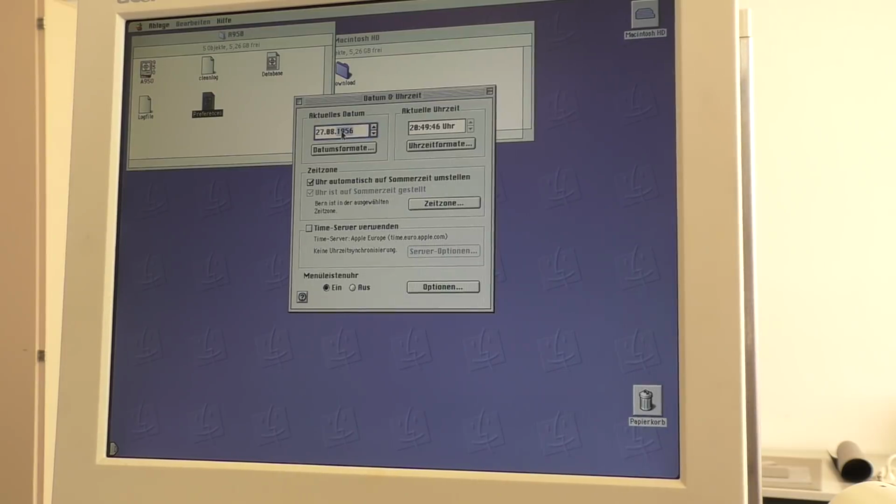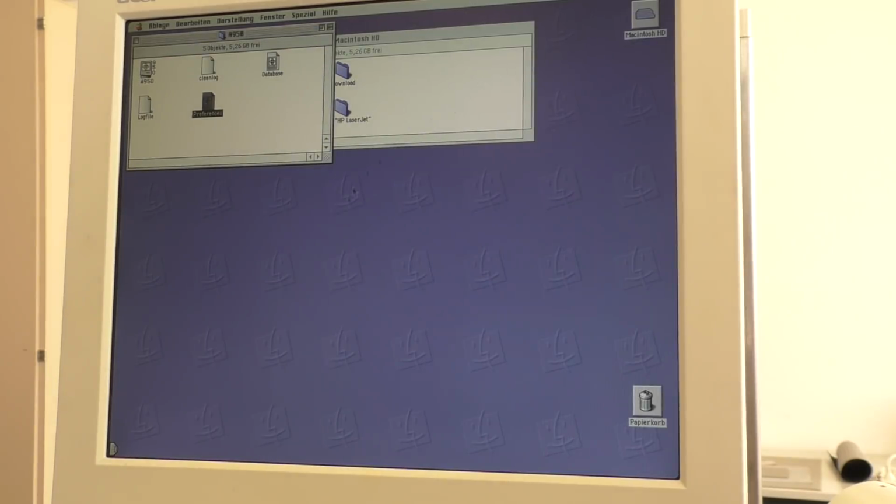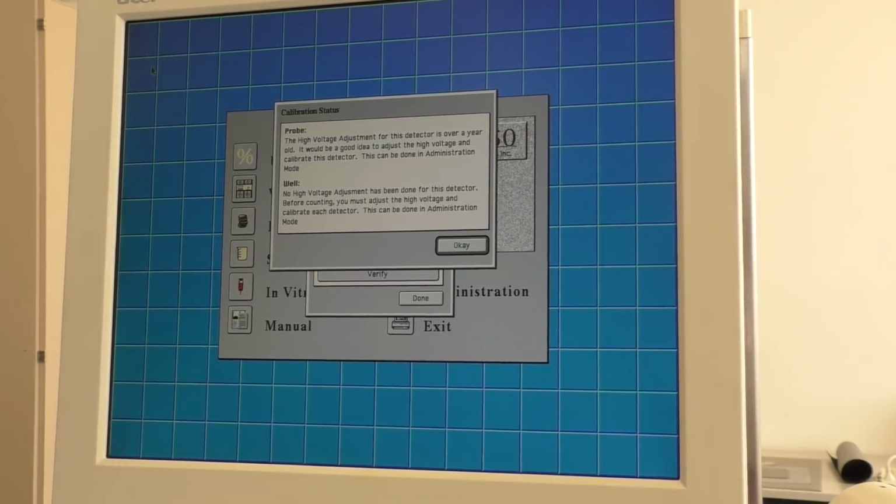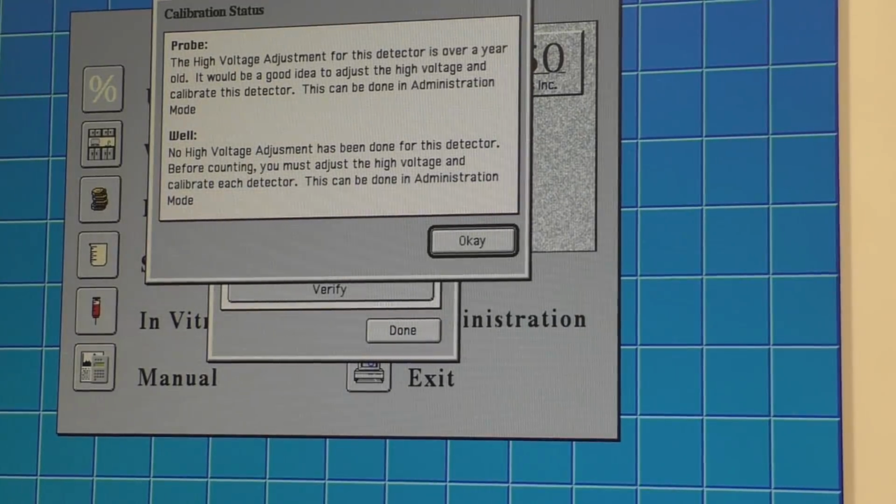1956, that is certainly not true. 2018, I hope it will not explode right now. It's the 21st. And it's, I have to guess, probably 1800, somewhere about that. Okay, close that. Time has changed and we start the application, the A950 app. Probe. High voltage adjustment is over 1 year. Yes, it stood in the basement for probably more than 1 year.